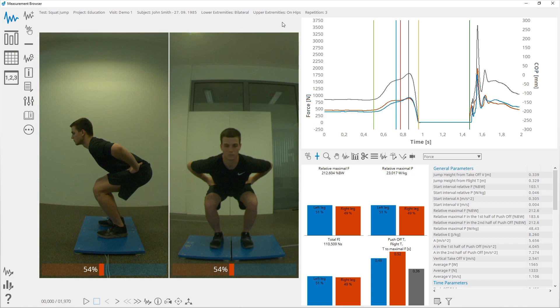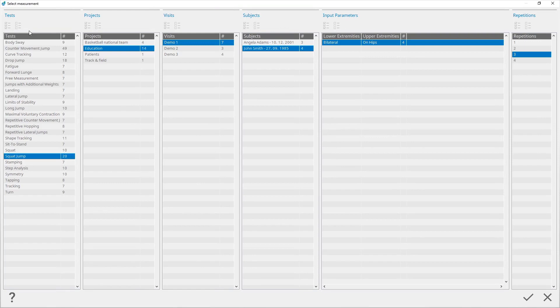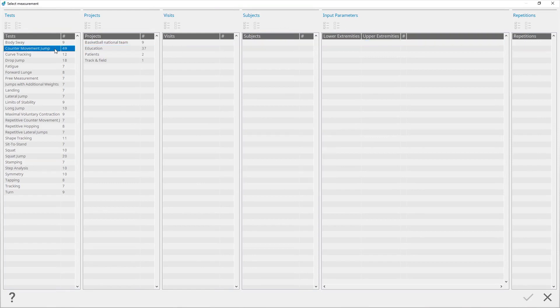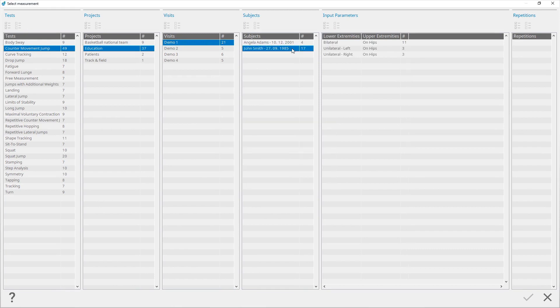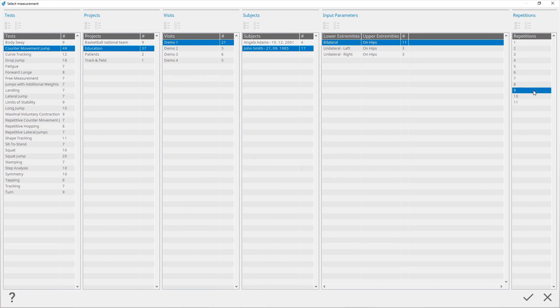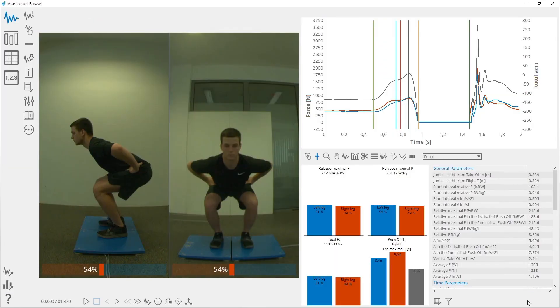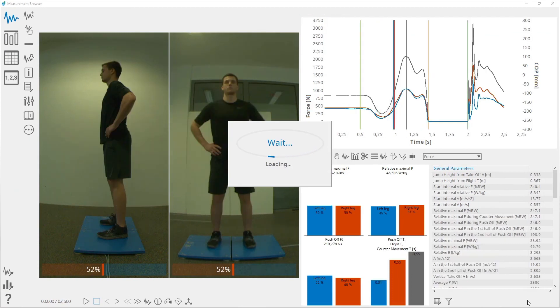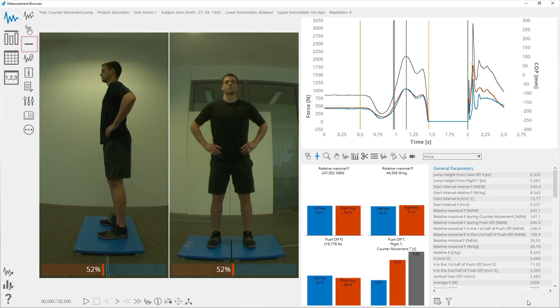By clicking on the New Measurement button you will start a new measurement. You can select a measurement by clicking on the Select Current Measurement button — select a project, visit, subject, test, and repetition for which you want to see the data. Delete a selected measurement by clicking on the Delete button.